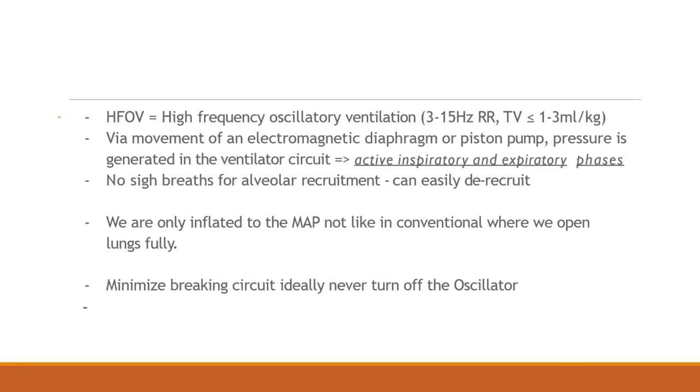And then the way it works is there's this electromagnetic diaphragm, or the piston. We'll use the word piston as we go through training and things like that, and that is generated into the circuit. The thing that makes the oscillator unique among all ventilators, and if you all remember way back in respiratory school, all exhalation is passive.